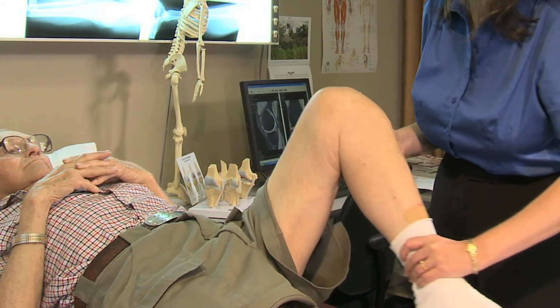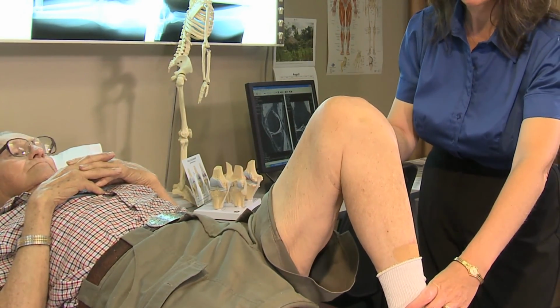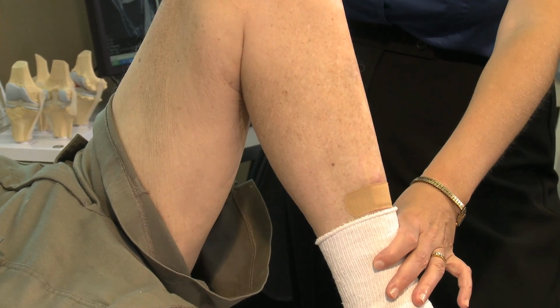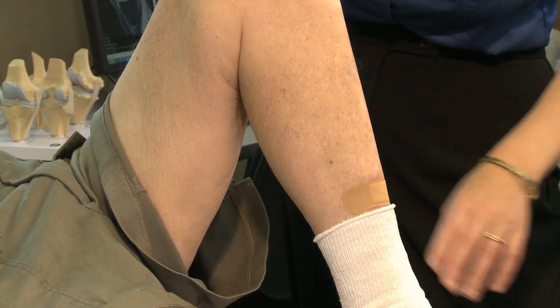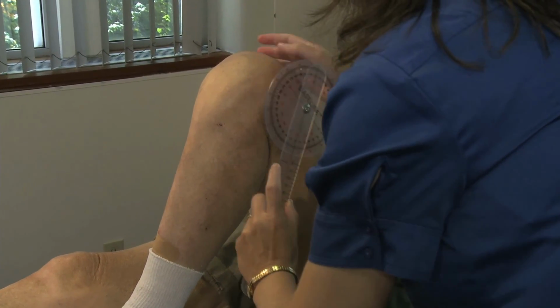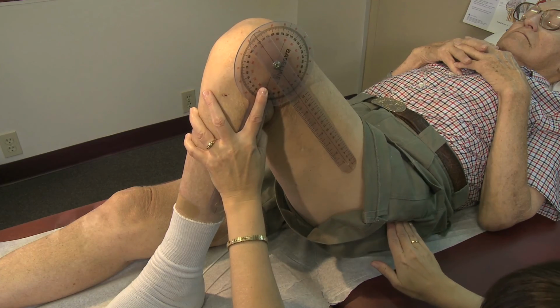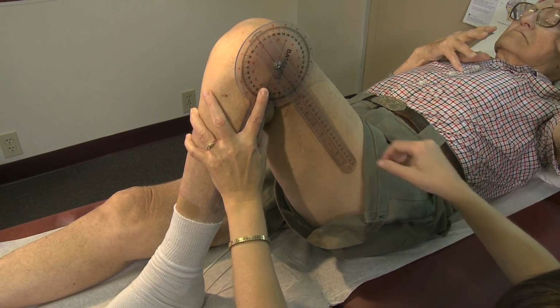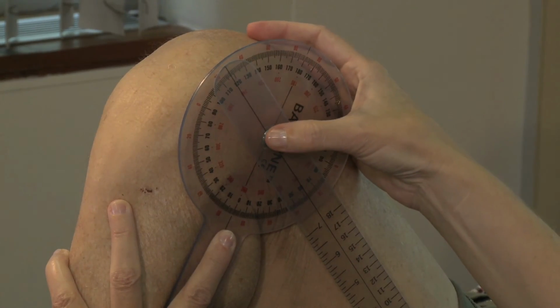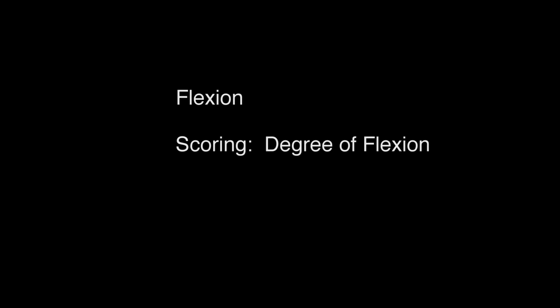Flexion range of motion. The subject is supine. The examiner asks the subject to flex the knee as far as possible with the foot flat on the examination table. The examiner centers the goniometer at mid-patellar level laterally over the knee and aligns one arm of the goniometer with the greater trochanter and the other arm with the lateral malleolus. The examiner then reads off the degree of flexion. Flexion range of motion is scored as the number of degrees of flexion.